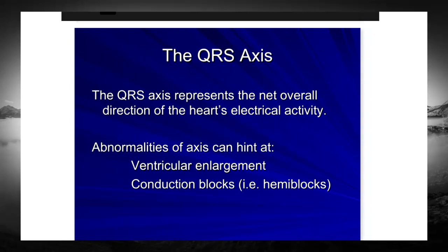So we talked about this briefly, and I said we'd get back to it later. So the QRS axis represents the net overall direction of the heart's electrical activity.